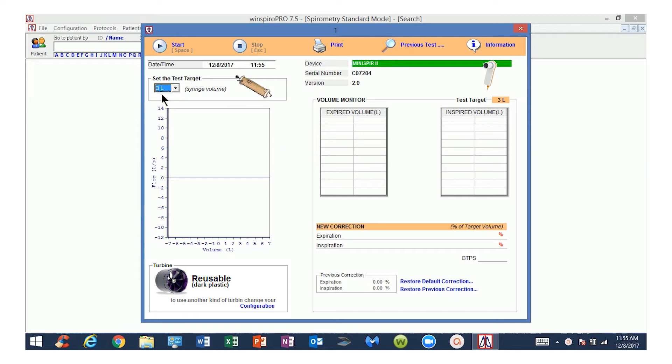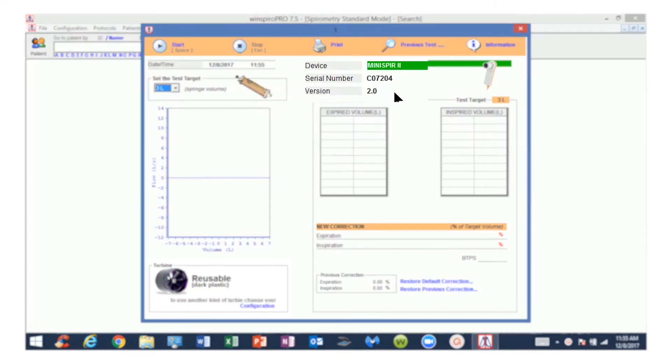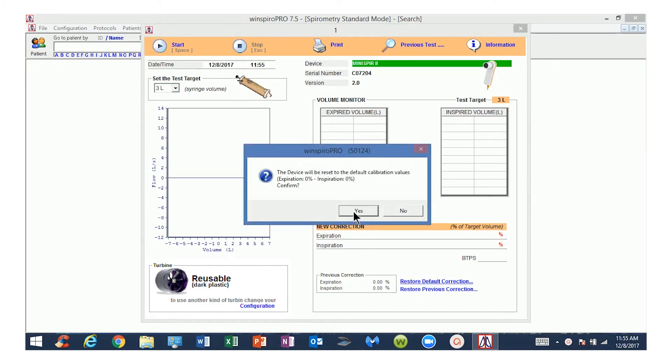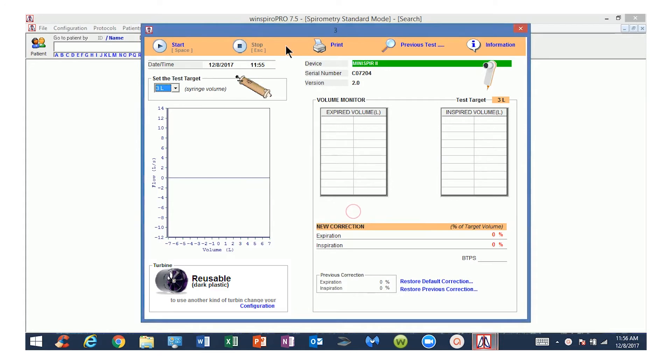In this video, we are using a 3-liter syringe. To the right of that, you will see the device that is connected with its serial number and firmware version. In the lower right corner, click Restore Default Correction and prepare the syringe by pulling the piston out fully.